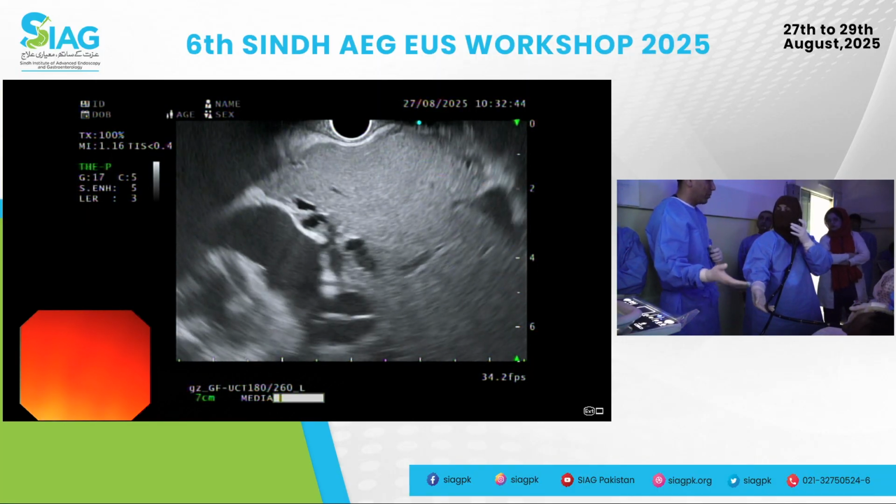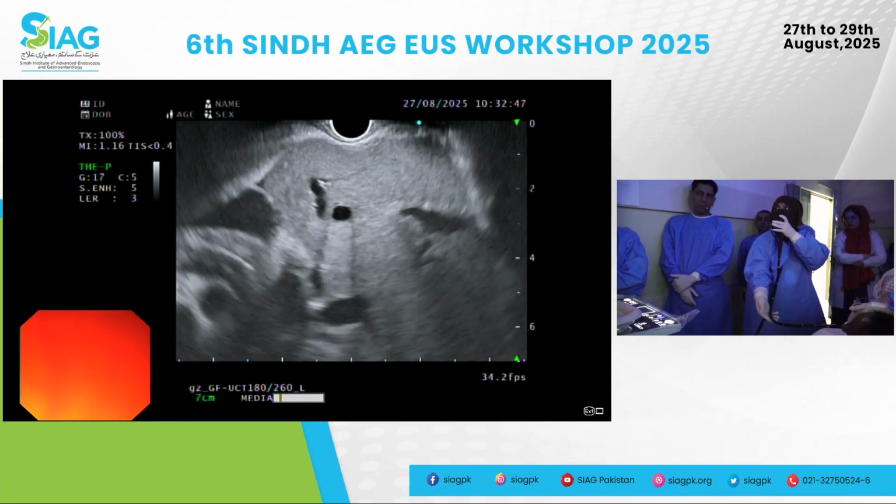Good, excellent. Now just keep going to the right, right, right, right, right.